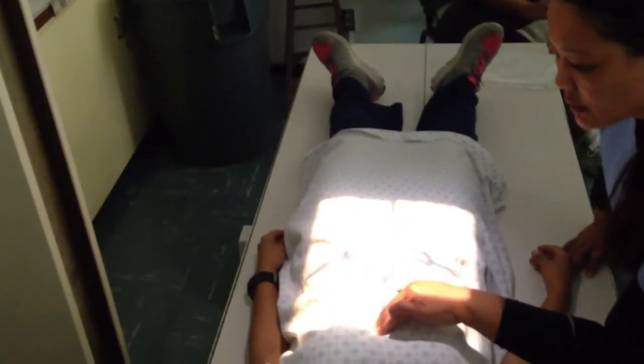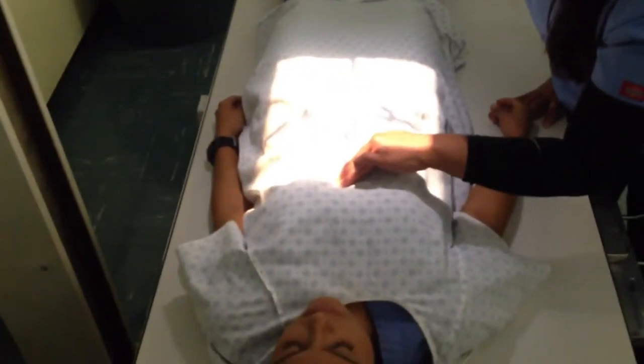Can you go four, higher, three inches above? Just to make sure — if you're looking at it and you say, 'I don't know,' use your scout, Catherine, to tell you. Because on your scout, you often see the stomach bubble.